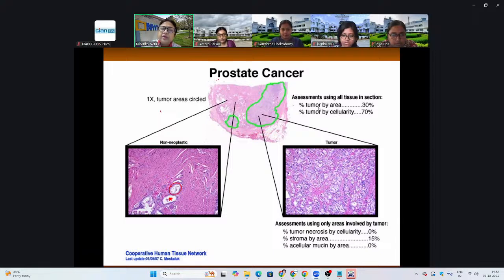If I were a histopathologist, I would look at a minimum of 6 different points. At least that's what we do for animals. It would have to be at least six different locations in order to get even an idea. So you look at them by percentage of tumor by area. You go by area, just what I did right now, and then you count the intensities.